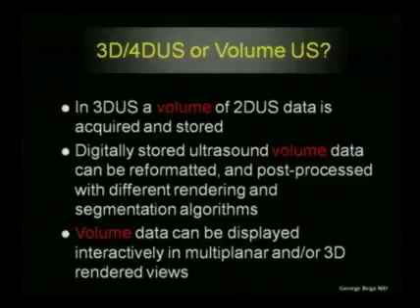3D, 4D ultrasound in clinical practice really becomes an issue of acquiring a volume. If we acquire one single volume, we typically would call that a 3D acquisition of one single volume, or if that volume is acquired in continuity, that would be called a so-called 4D acquisition. 4D supposedly is the fourth dimension, since we will be able to pick up motion of the fetal anatomy. Typically, faster acquisitions or 4D acquisitions are needed for moving targets.